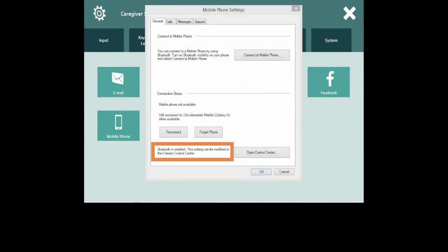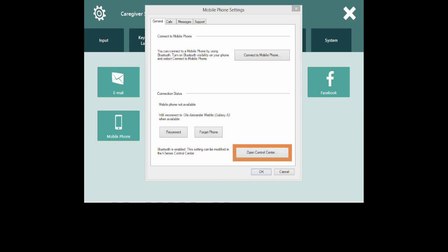Make sure that Bluetooth is enabled in the Mobile Phone Settings menu. If it's not, select the Open Control Center button and then select the Enable Wireless Units checkbox. When you're finished, close the menu.